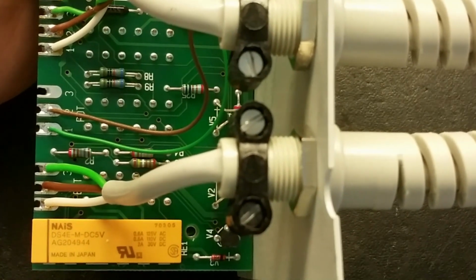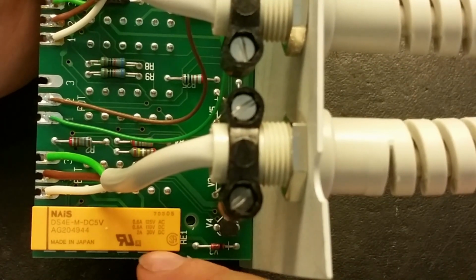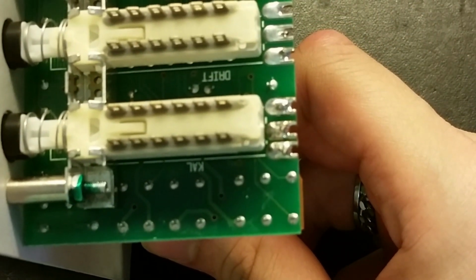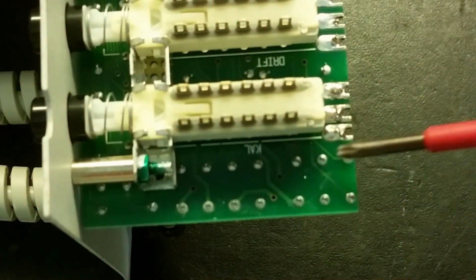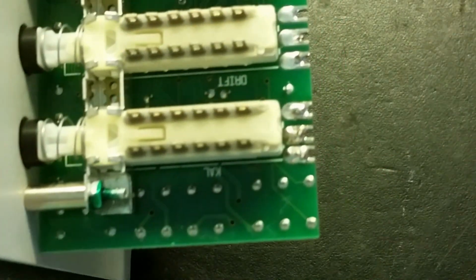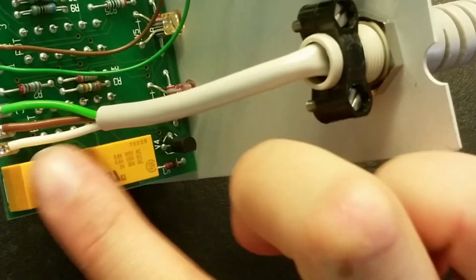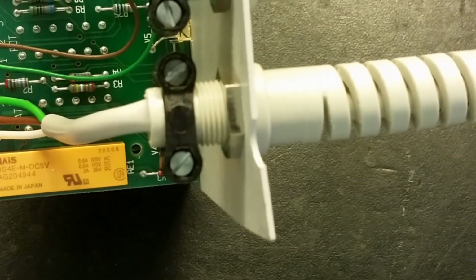Actually, I have to say something about this relay. It's pretty special. It's a 5-volt, and we've got a bunch of different voltages here, that show how much you can switch. If you flip it around, we can see that it has 4 pairs of contacts. We've got the coil in the middle here, and we've got 1 pair here, 1 here, 1 here, and 1 here. I've never seen such a big relay in such a small package with 4 contacts in it. Pretty special thing. And pretty high quality relay as well.